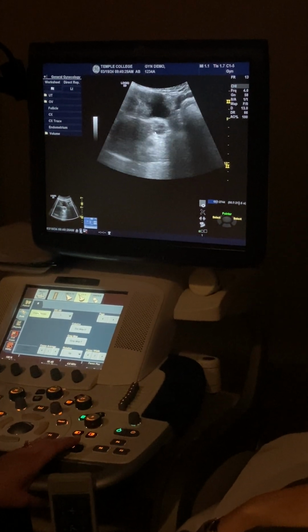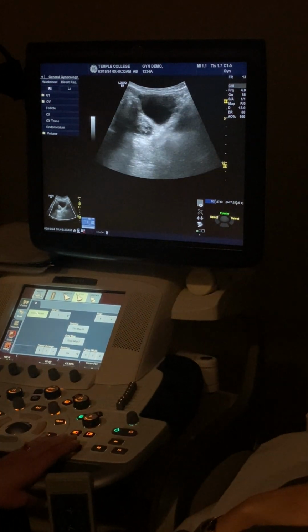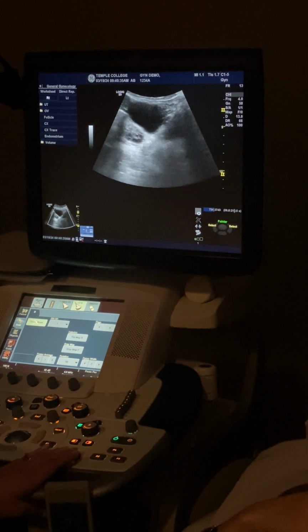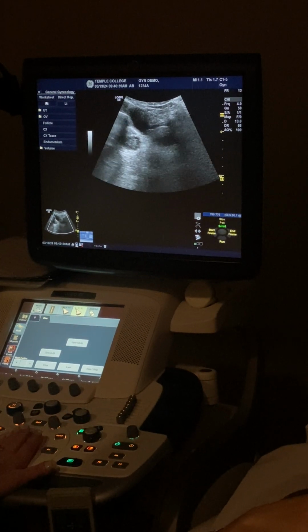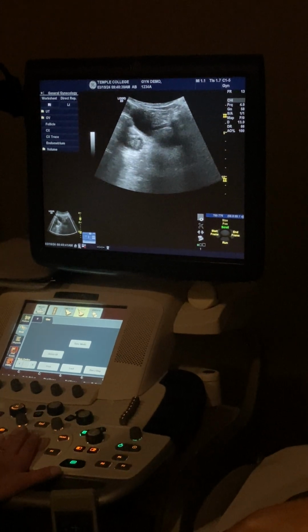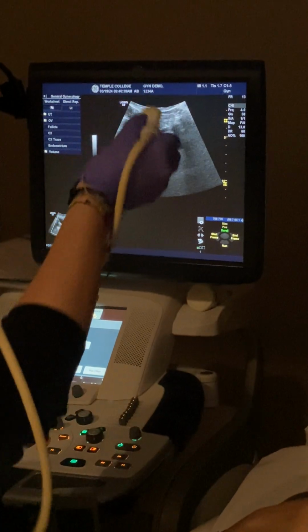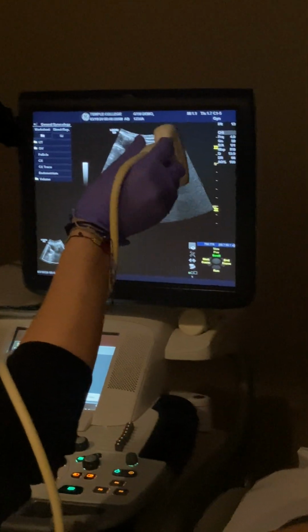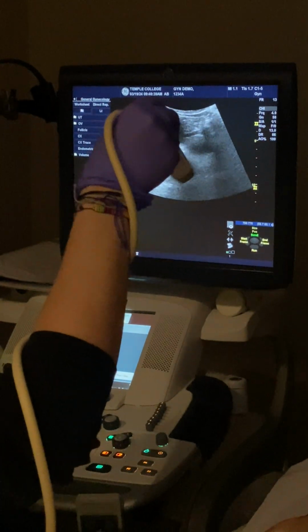Looks like trans, right? But I don't know that until I kind of move around on it. So once you find it, look at that. Now do we see how much bigger it is? Sorry, love, I know I'm really pushing on you. Gas, get out of here. Okay. So now I've kind of found it, and then I'm doing this. Okay? I'm not doing just this, because I need to see the shape.